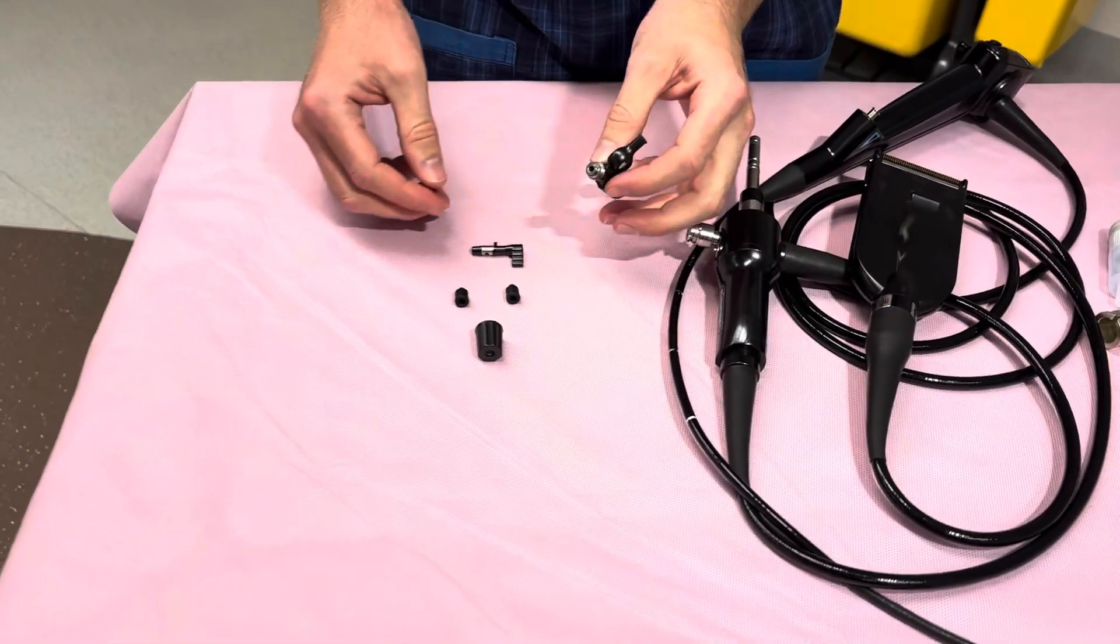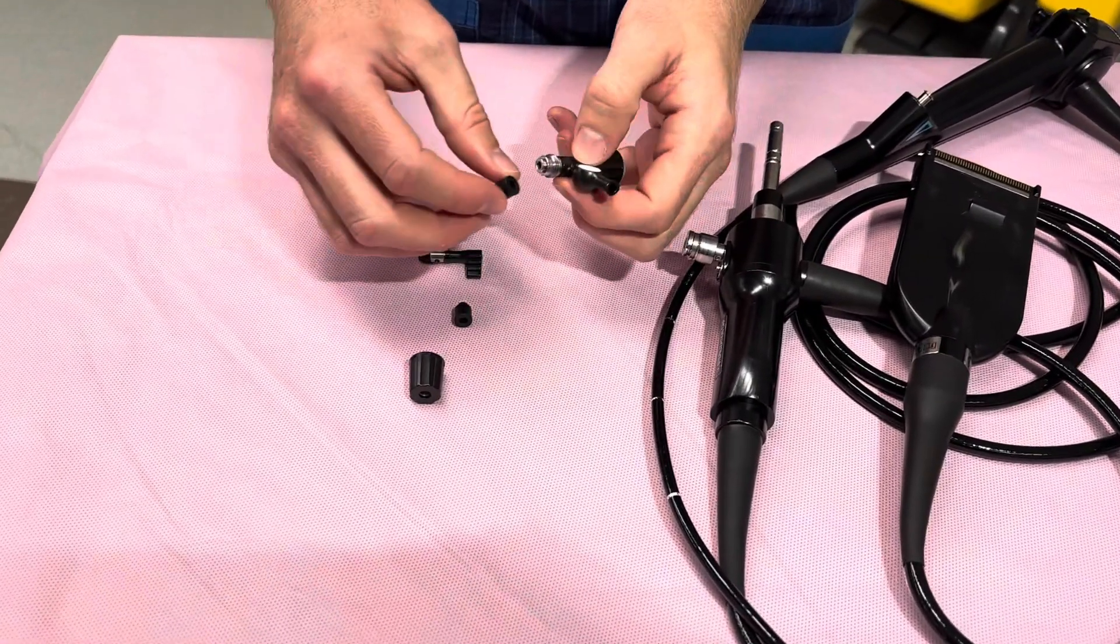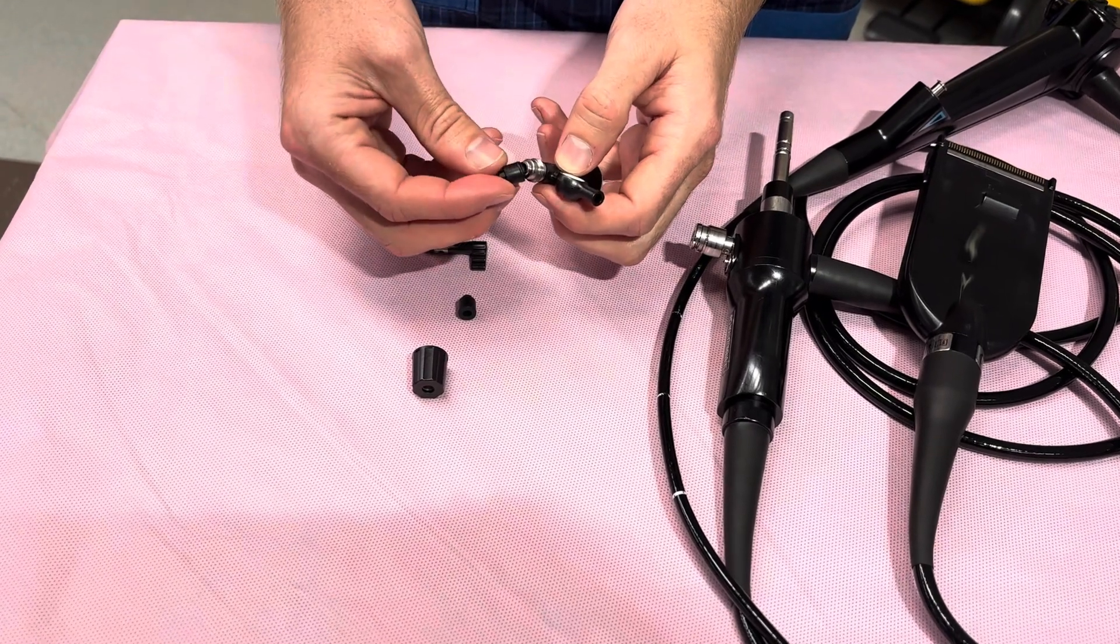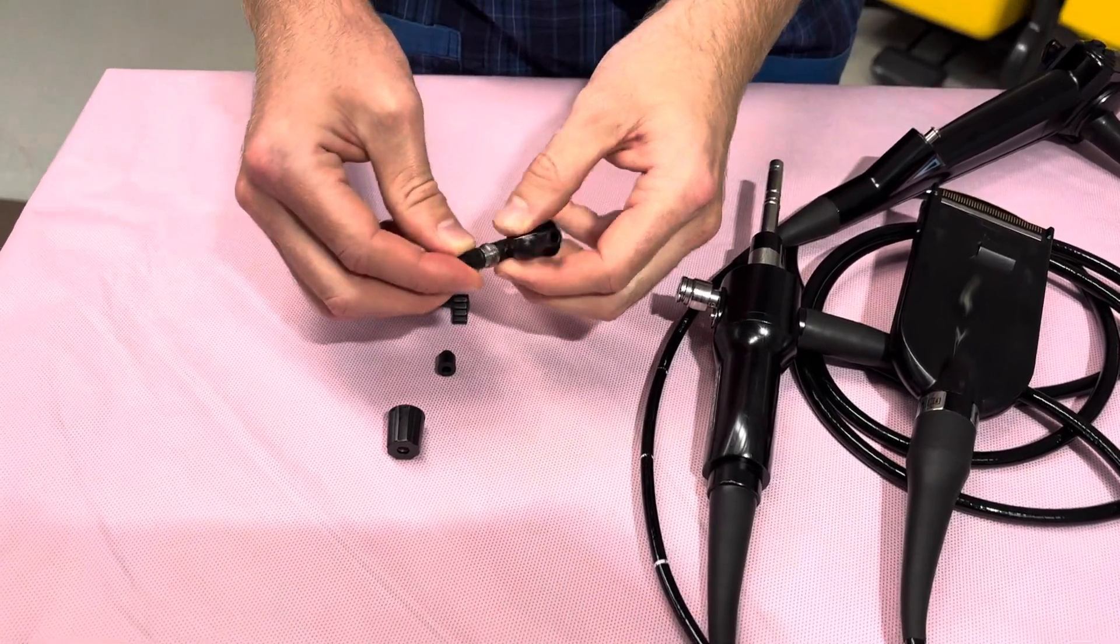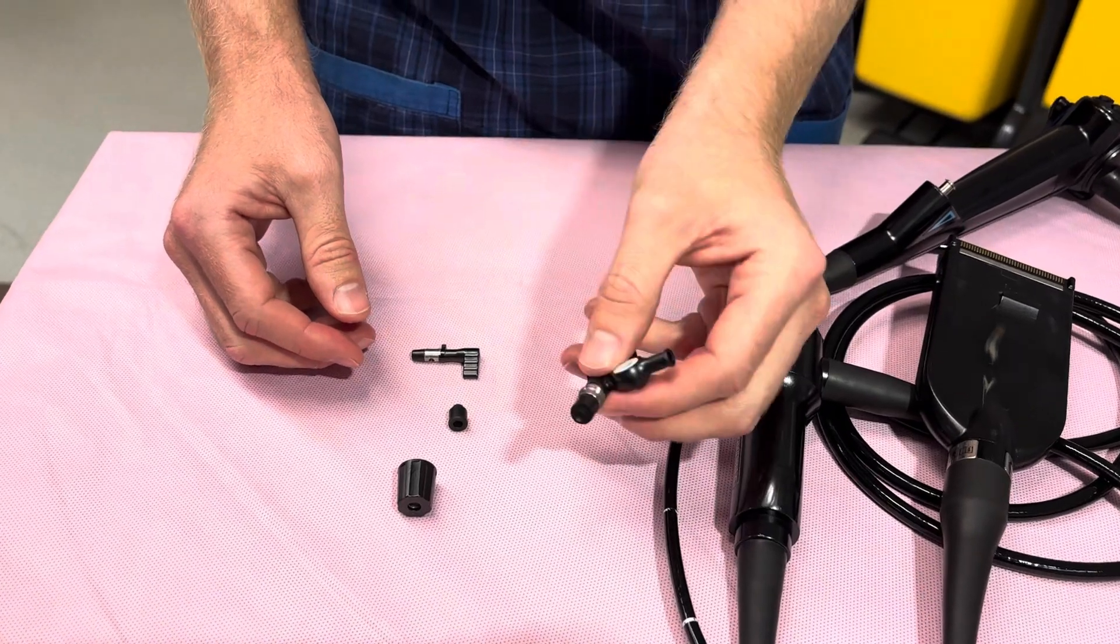Step three: grab a rubber bung and place it on top of the silver like that. Always make sure you do that step first and ensure it's sitting nice and flush.